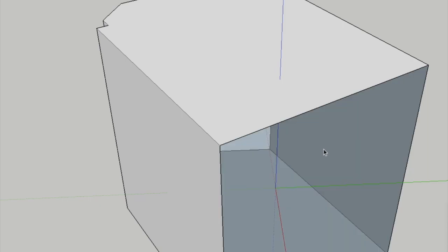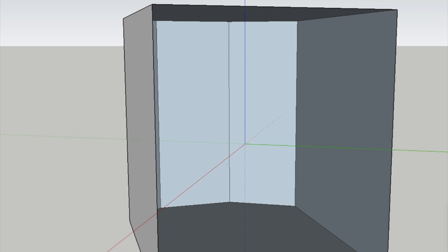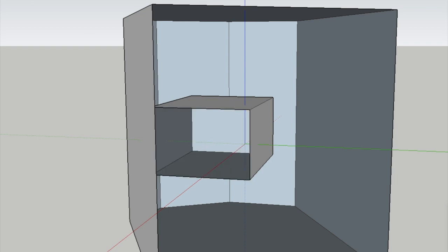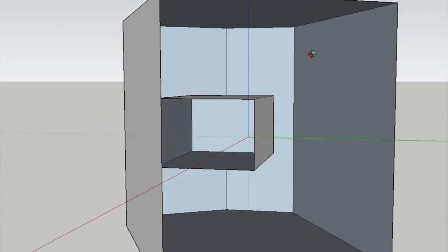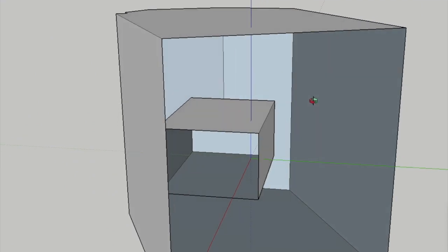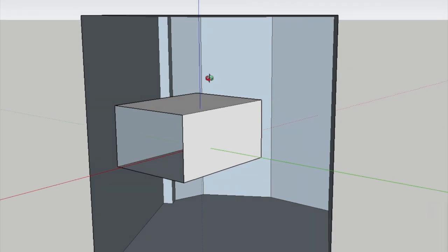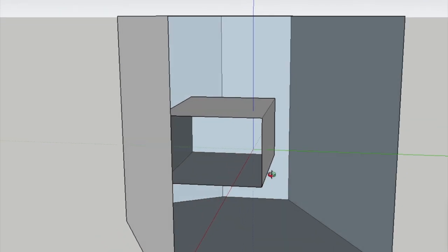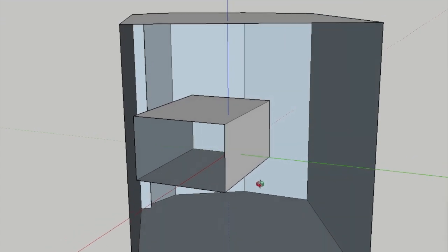We can hide the front face of this box and rotate it a little bit so that we can see the sheer volume of that shielded area, and then we can switch on the box that we need for the fixed beam room and also hide that front surface. And now we can see that incredible size difference of the shielded area. That is the area that we need to shield from radiation if we want to build a fixed beam room versus a Gantry treatment room. The volume difference is north of 15 times, which is quite substantial.